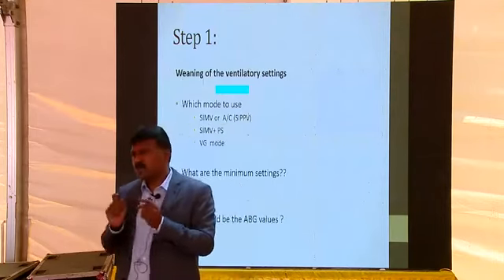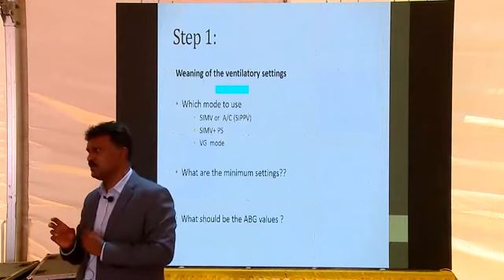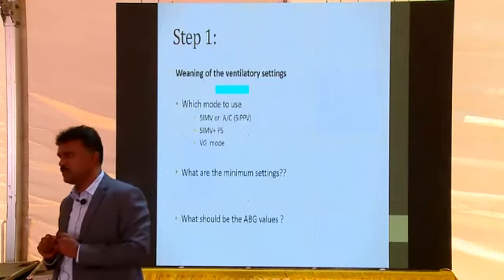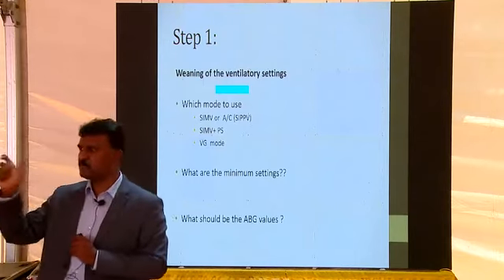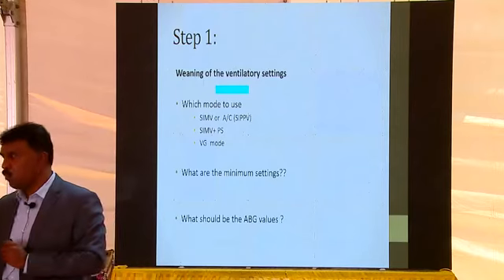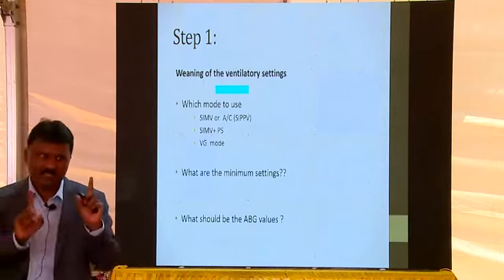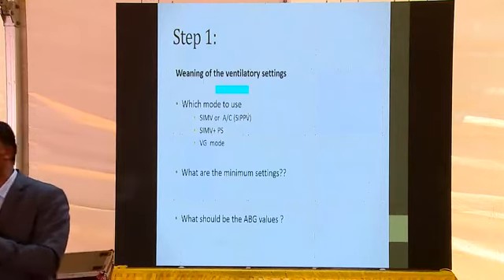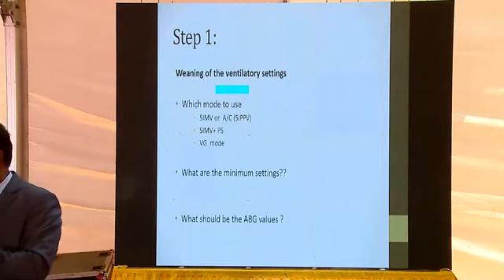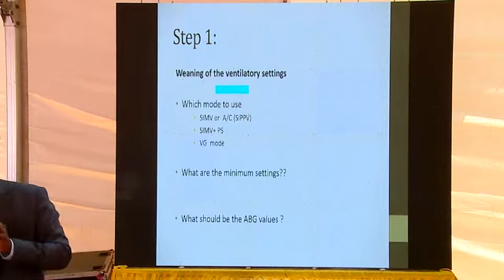Now people who are feeling very bad that these 40 breaths are not supported, this is where SIMV plus pressure support comes in. Set breaths, those SIMV breaths, and the remaining 40 get only pressure support. A little boost, he decides his own inspiratory and expiratory time. It's just giving a small boost which will help him to support these 40 breaths.